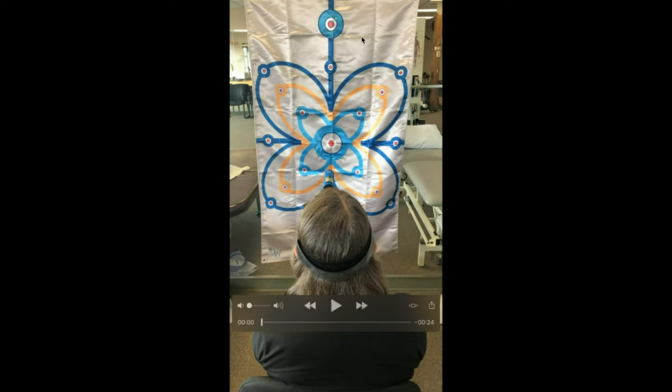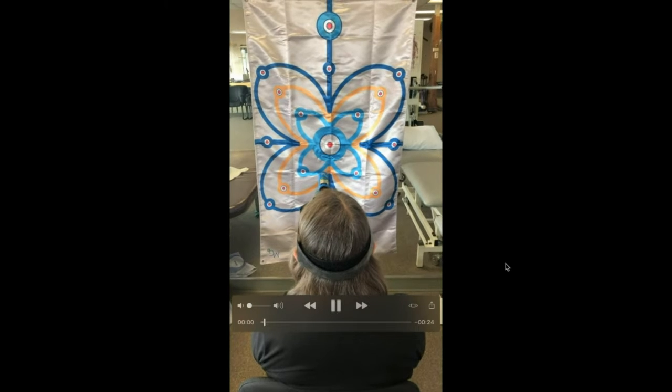You'll notice titubations. So you'll notice an irregularity of smoothness of the excursion of the laser side to side. We need to figure out why that is. We also are going to notice a tendency to have increased left laser excursion here. So her right eye tends to be dominated forward when she's in that position, versus toward the right, which would be left eye dominated in that position. So nose to the right is much less excursion than to the left. So let's take a look at those two things again as we roll this through.